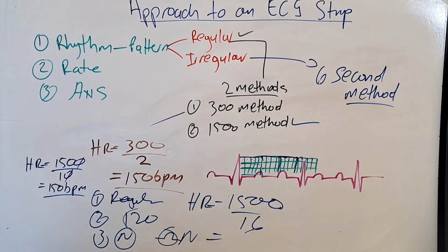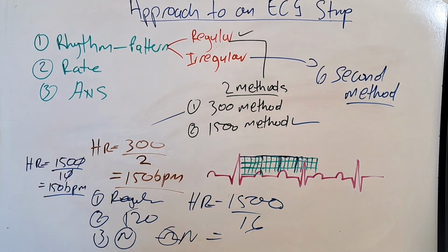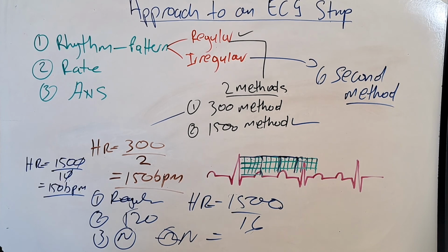One thing that I also want to say is that you don't have to know how to interpret an ECG to actually do one. As long as there are people who can interpret it for you, you are fine. The danger would be not doing an ECG at all and then finding out later that you were supposed to do one for the patient.